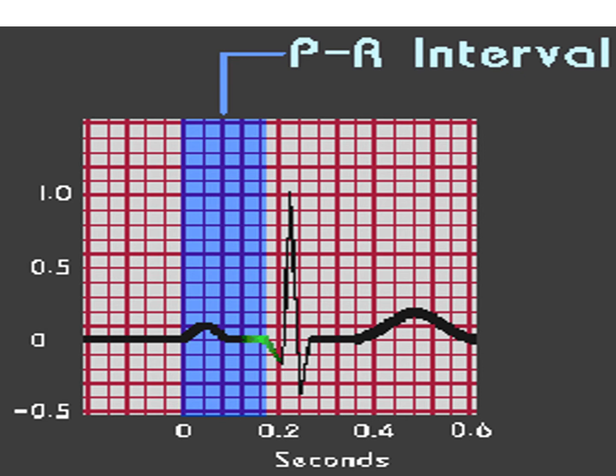If you have a shorter one, less than 0.12 seconds, you'll see that more so in a tachycardia. Then if you have a prolonged P to R, like over 0.20 seconds, you have a delay in the conduction system, okay? So that's probably an AV block, okay? An analogy here is if you shoot a gun and there's no velocity behind the bullet, it won't do any good. It's the speed that allows it to cause any damage, okay?